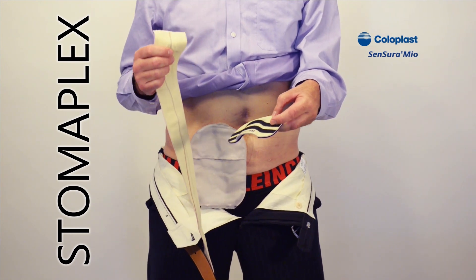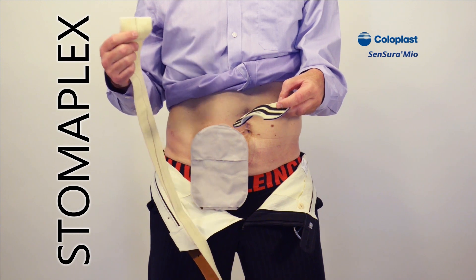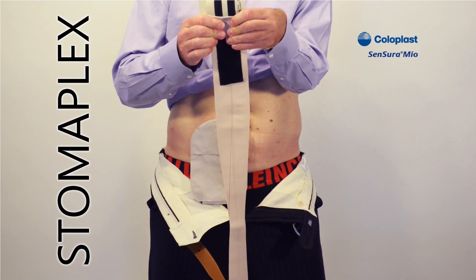Now I'm going to show you how easy it is to wear the ostomy guard and belt together. The belt comes separate and included with every one of the guards. The belt attaches very easily to the face of the guard, just like this.